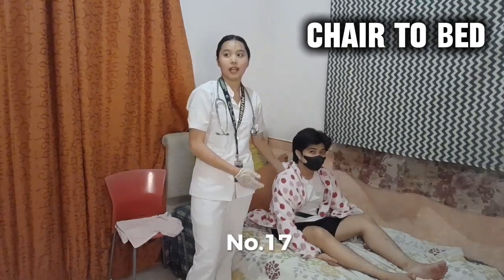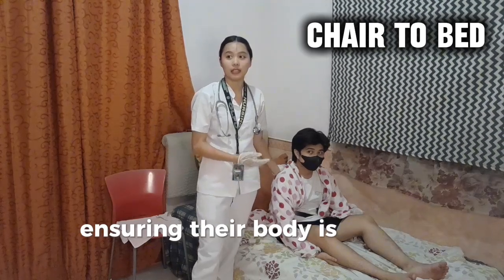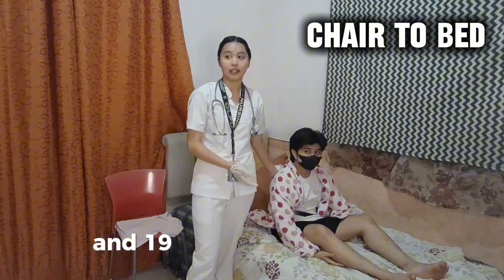Number 17. Help the patient move to a comfortable position in bed, ensuring their body is aligned properly. 18. Cover the patient with a blanket. And 19. Remove the gait belt.